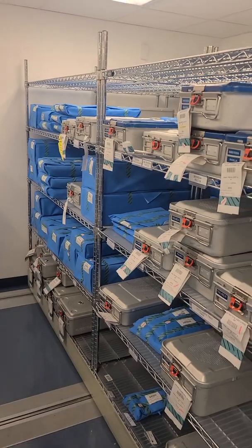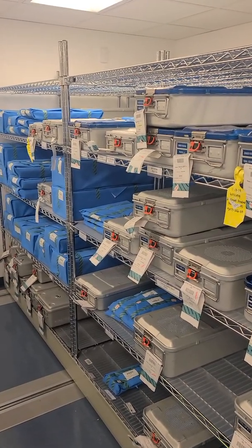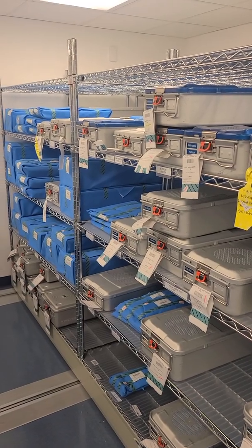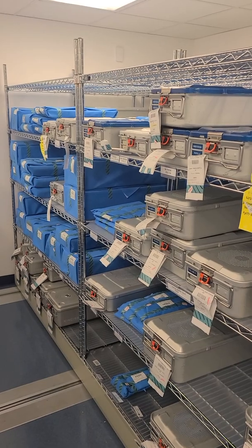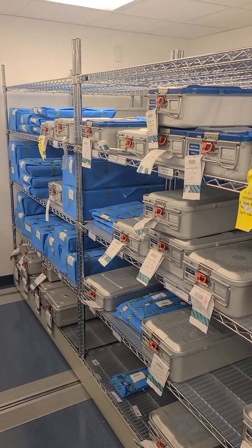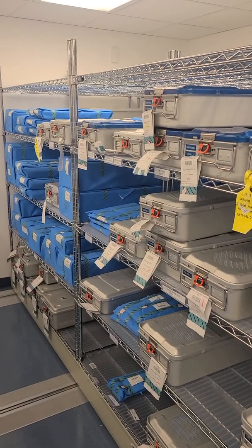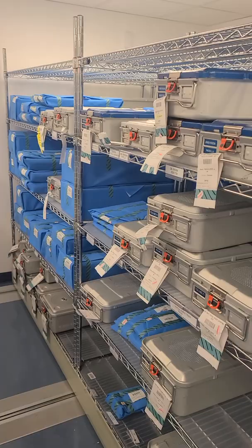Typically I would show you where this stuff comes from, but then I would be ruining the step of sterilization, which is to me the final step. But let's be real — the beginning is the end. Storage is the beginning and the end of the cycle, but we're going to start at the very beginning.